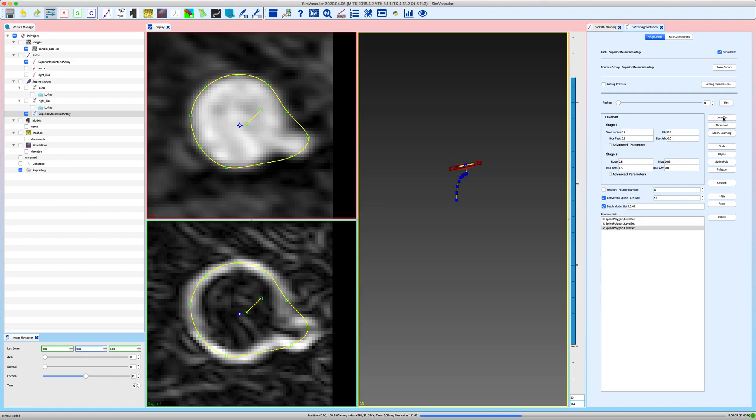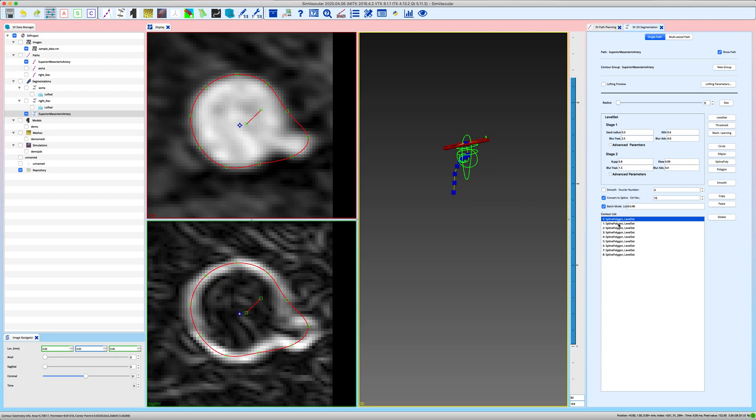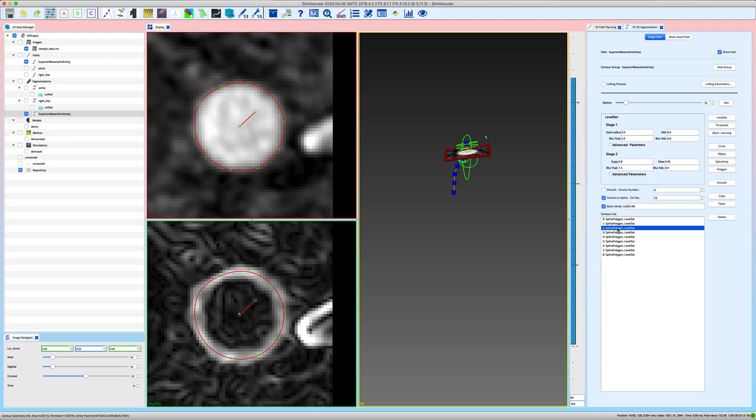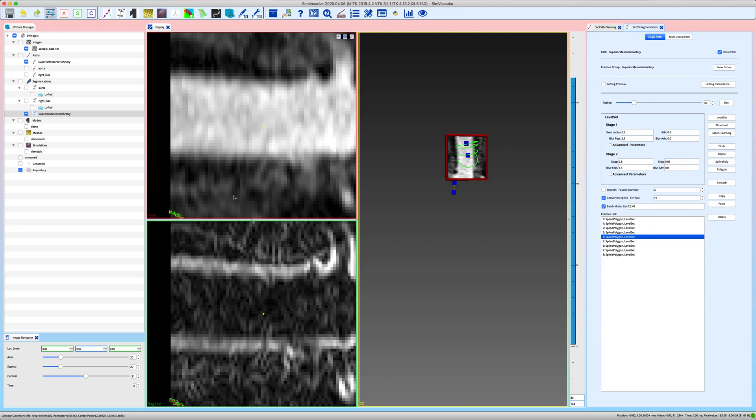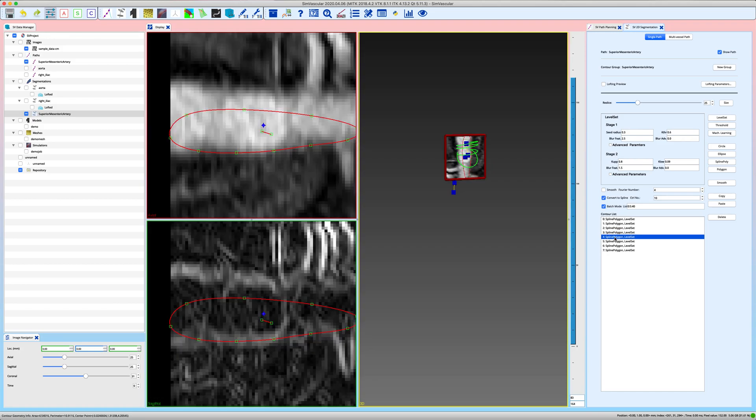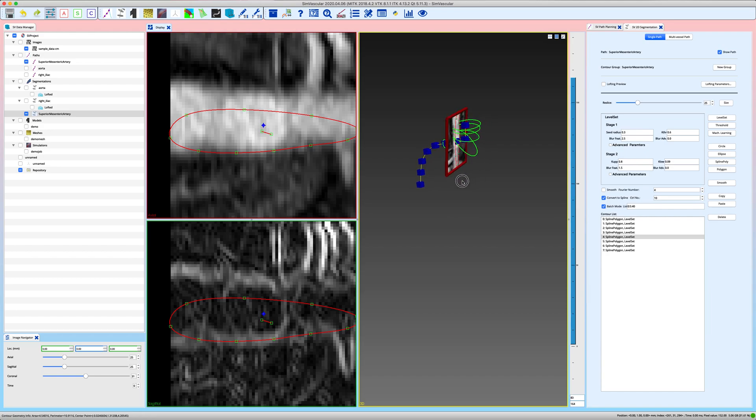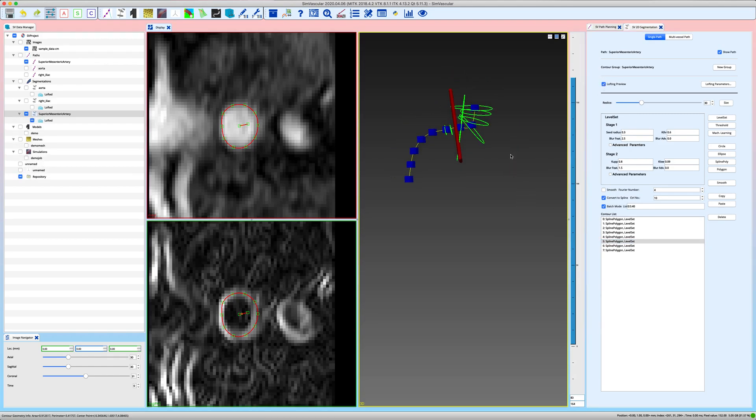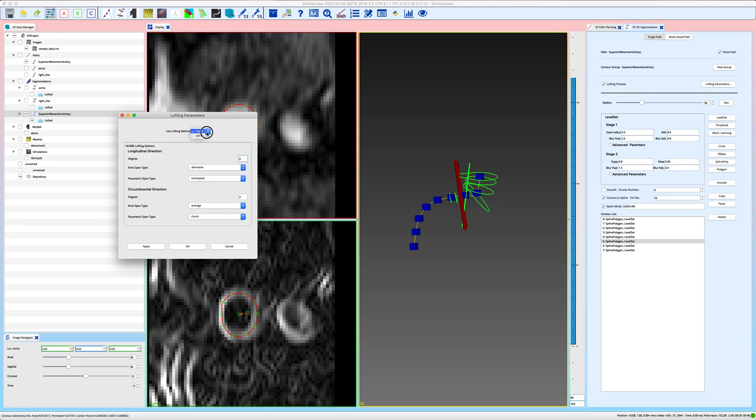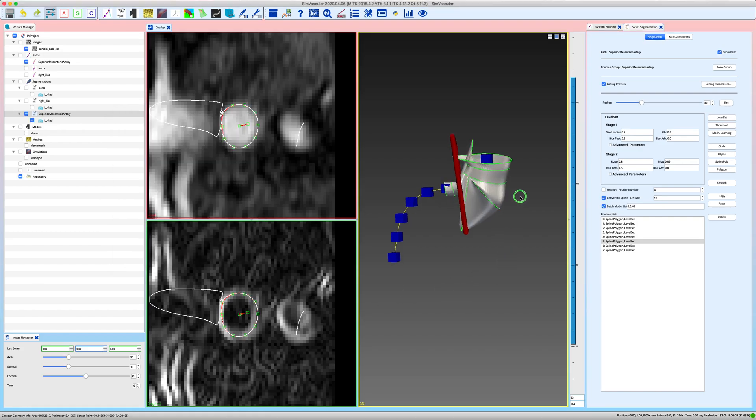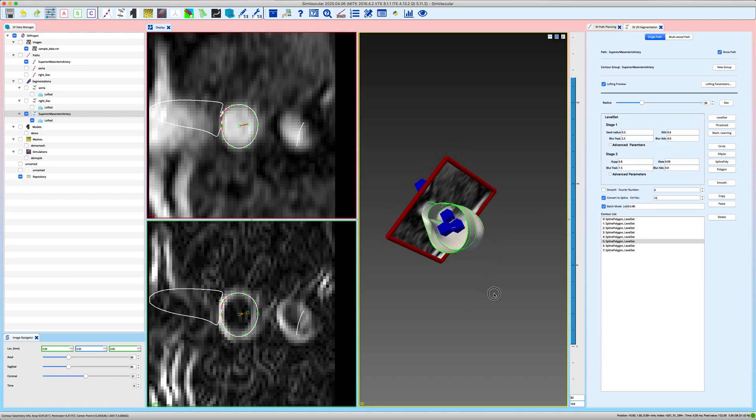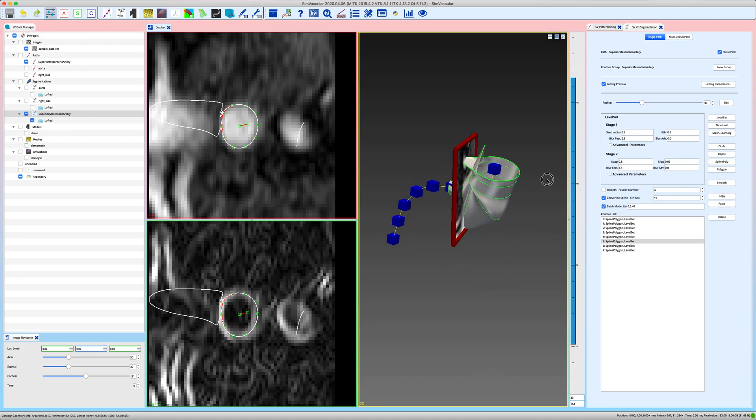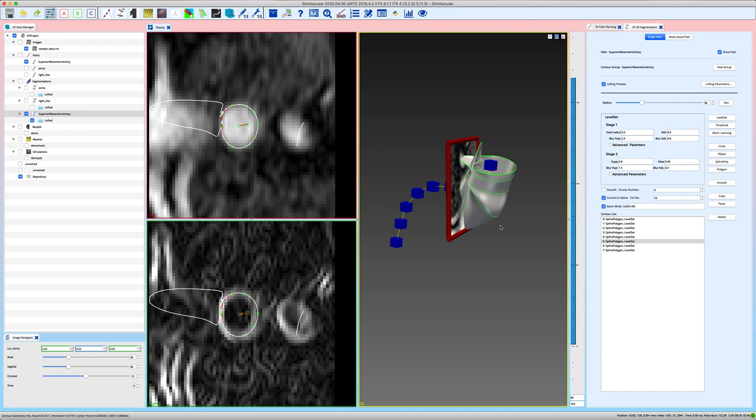Click on level set and see what we're getting. So let me first check those. So this level set is clearly wrong, I'm going to delete that. This one here is also pretty wrong, but I'm just going to leave that in for the sake of the demonstration of the overlapping segmentations. And now if we toggle on the lofting preview, first nothing happens. Let's check the lofting parameters and switch to spline and say apply. And you can now see how your resulting lofted model is just not correct. It's self-intersecting and that's the main reason why you should never have overlapping segmentations. They will not result in a correct model.